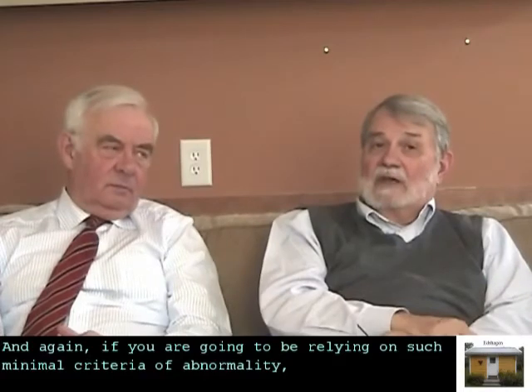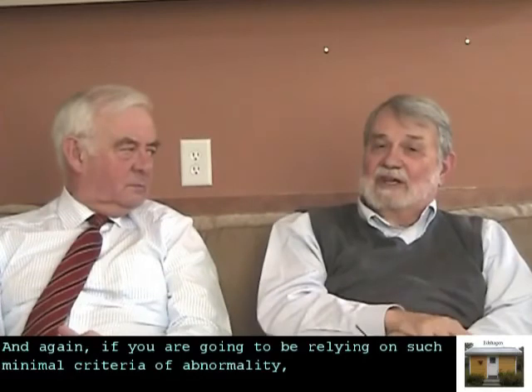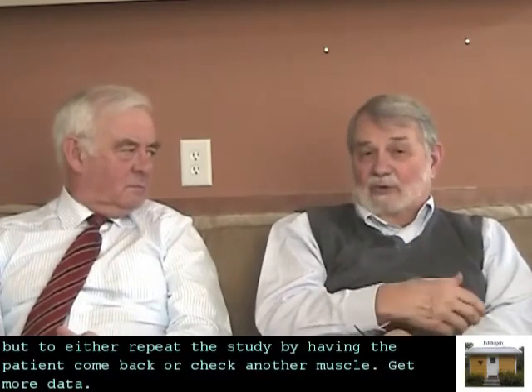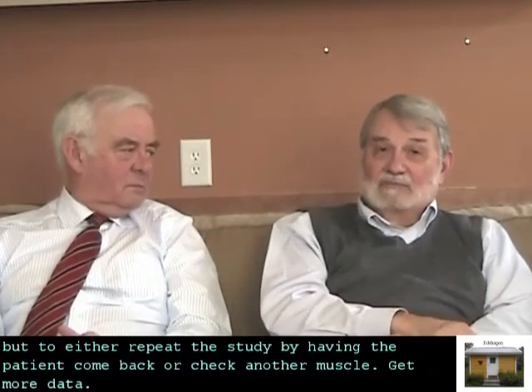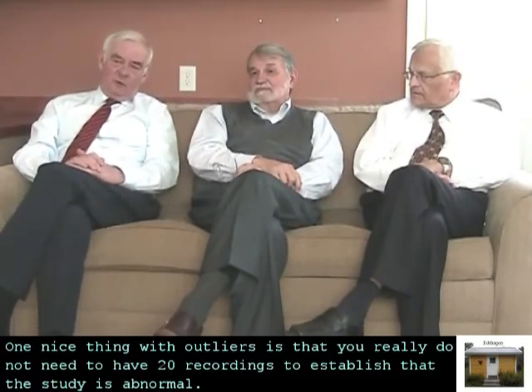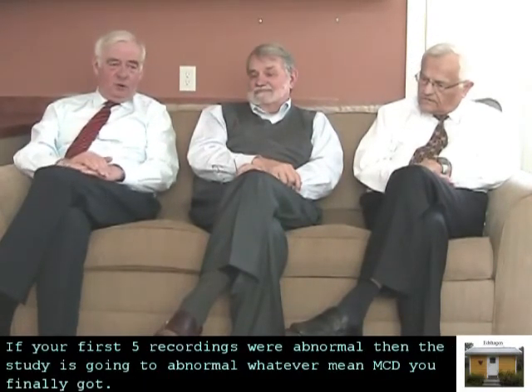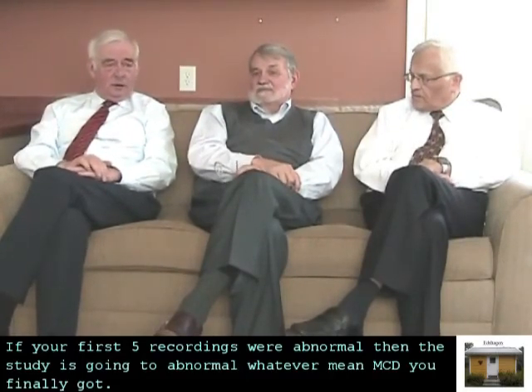And again, if you're going to be relying on such minimal criteria of abnormality, then it's wise not to make a diagnosis based on such minimal findings, but to either repeat the study by having the patient come back or check another muscle, get more data. One nice thing with outliers is that you really do not need to have 20 recordings to establish that the study is abnormal. If your first 5 recordings were abnormal, then the study is going to be abnormal, whatever mean MCD you finally got.